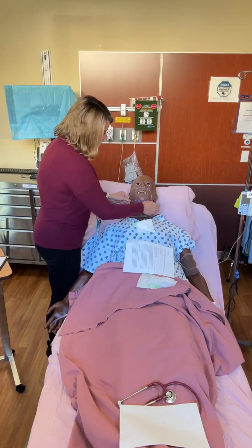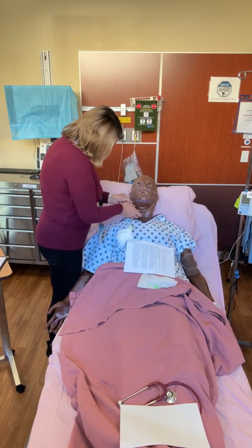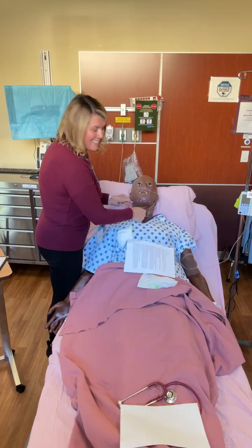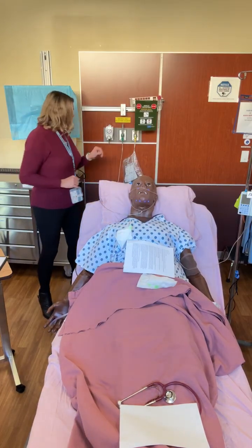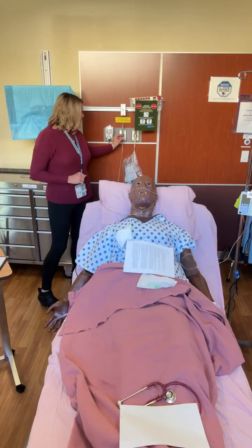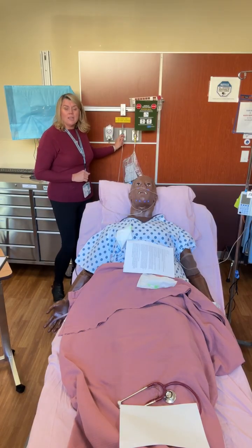All right, so that is not staying like I want it to. So we're gonna choke him with it. Don't do that in real life. Okay, so that's in there. And then I'm gonna turn my oxygen flow meter up to whatever that doctor ordered.